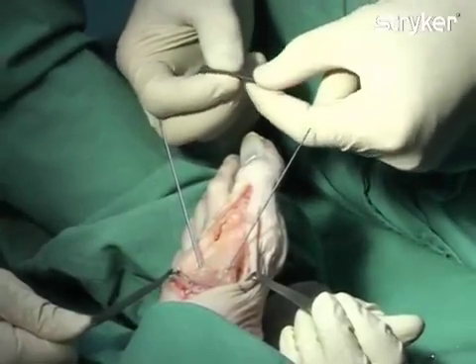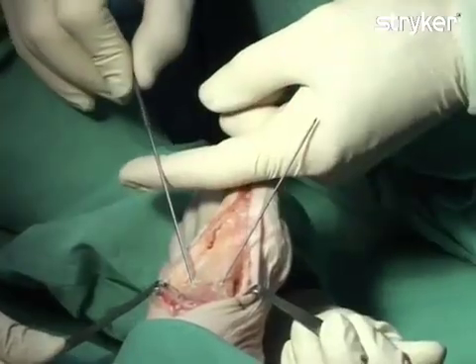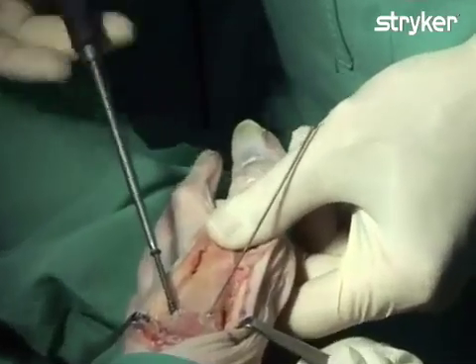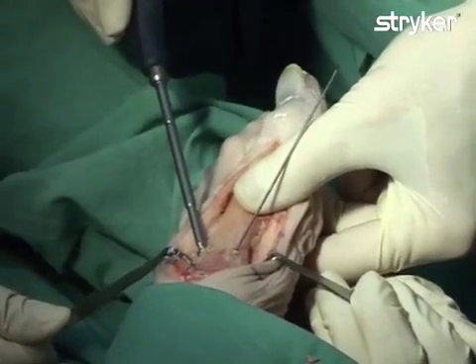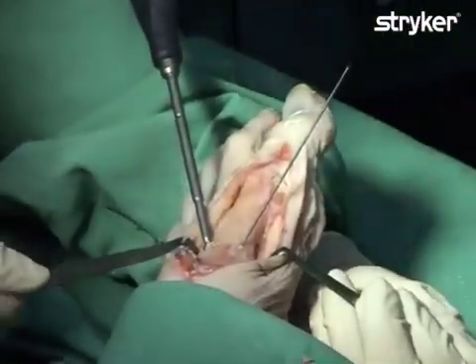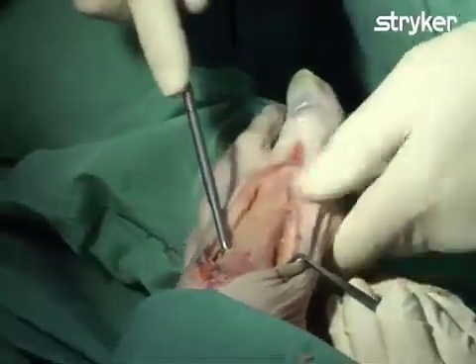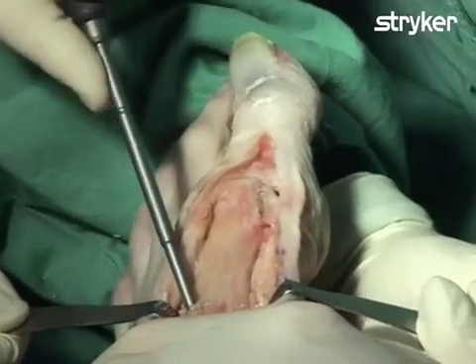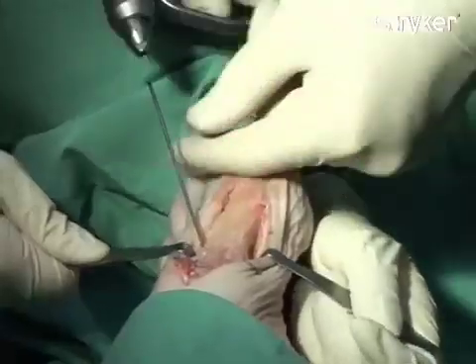An ASSIS III 4.0 mm diameter self-drilling and self-tapping cannulated screw is now inserted over the K-wire. The cannulated screwdriver is then used to insert the screw into bone. The screw is advanced until the screw head makes contact with the cortex. Before final tightening, the opposing crossing K-wire must be removed, as it will prevent compression from occurring. The ASSIS III 4.0 mm screw is now tightened and the K-wire is then removed.